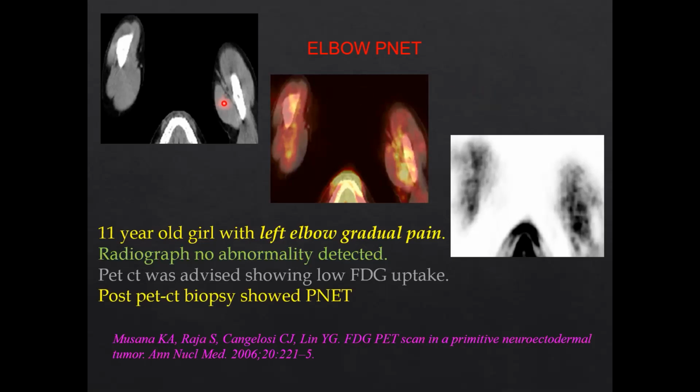Very unusual, we can't make it out unless it is very subtle. And this is a plain CT. That is one of the reasons why, if you give IV contrast, the characterization of the soft tissue within the lesions becomes better, and that adds to the diagnosis of the PET, because necrotic areas, neovascularizations, these are the things which you can see after giving IV contrast in the CT.